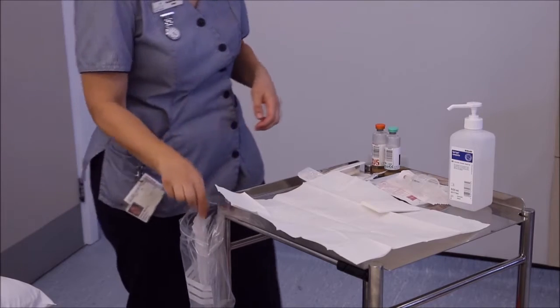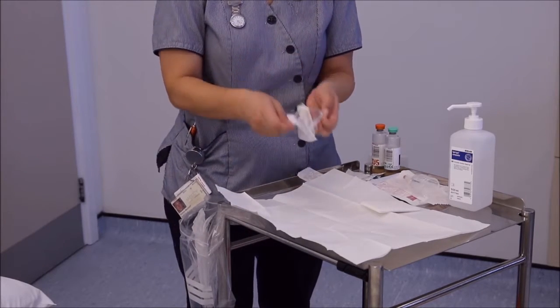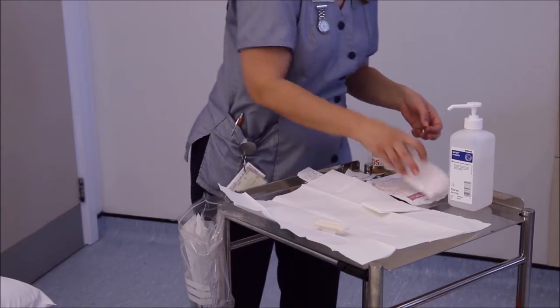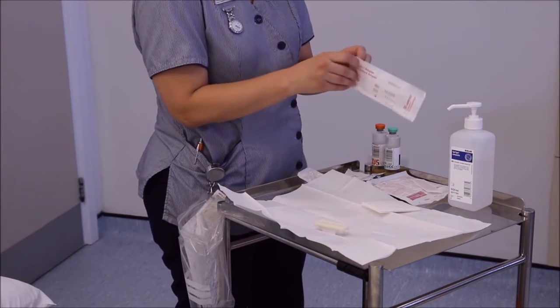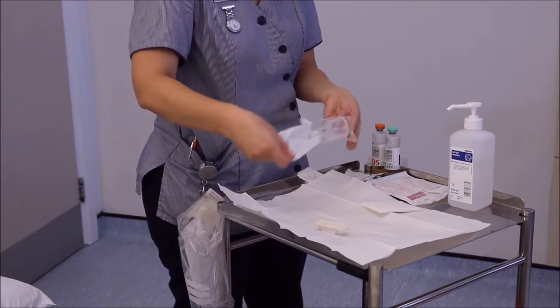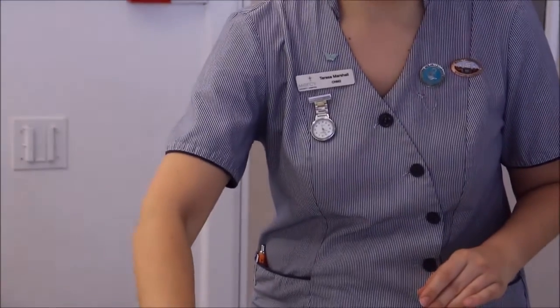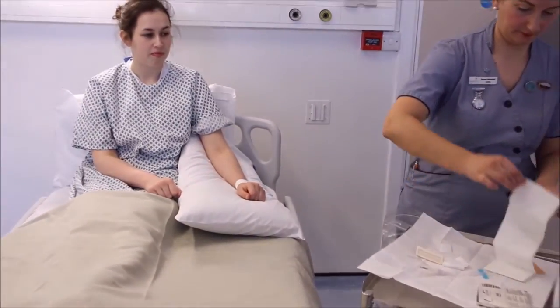Check expiry dates. Using aseptic non-touch technique, i.e. without touching the key parts, assemble the winged butterfly infusion set to the blood culture adapter cap.